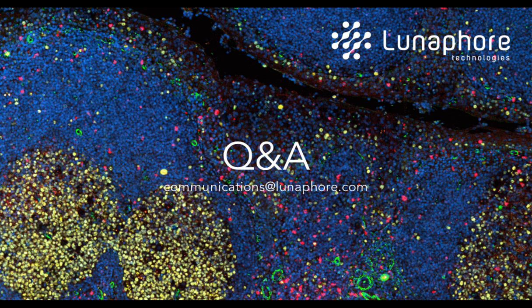Another attendee was asking if you could clarify how you erase the signal in this application. Yeah, this is a very important point. We've been optimizing on this since the very beginning of the development. So it's a combination of low pH and a detergent and heat. And what we do is we elute, so we really remove the complex of primary and secondary antibodies from the tissue.